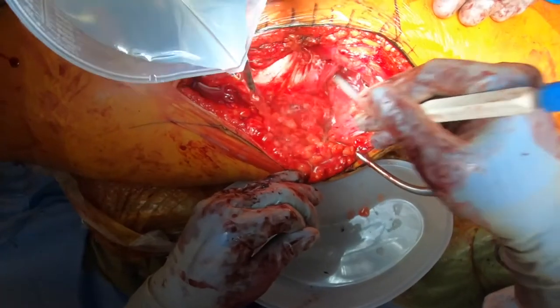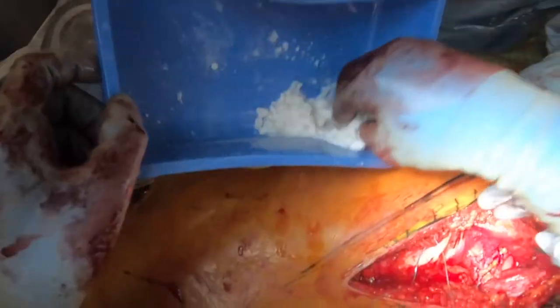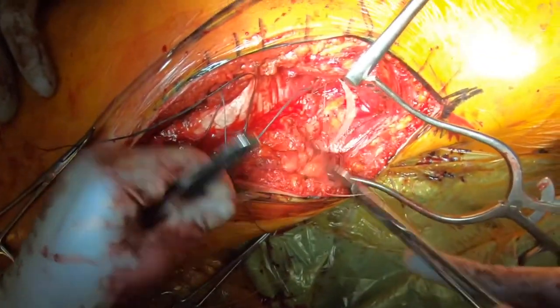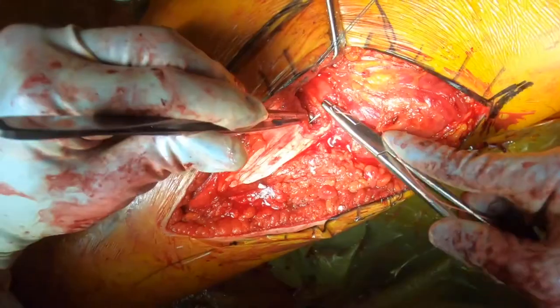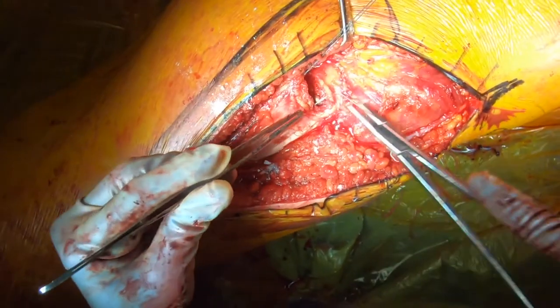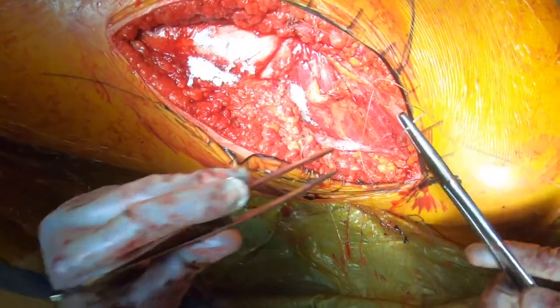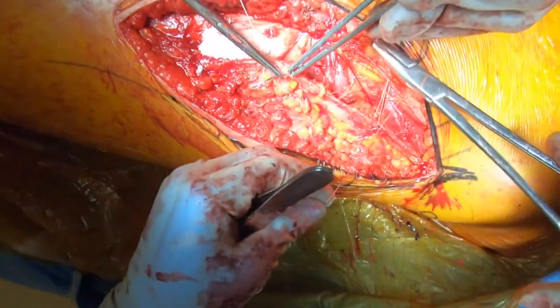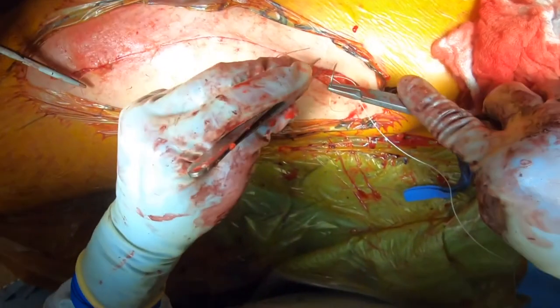The wounds are then copiously irrigated. Bacitracin and tobramycin antibiotic powder is then placed in the wounds. The capsule is then closed with Vicryl. The partial transverse cut along the vastus ridge is then repaired with use of Vicryl in horizontal mattress fashion. The IT band is then closed in figure-of-eight fashion. The remaining wound is then closed in layered fashion with Vicryl and skin staples.